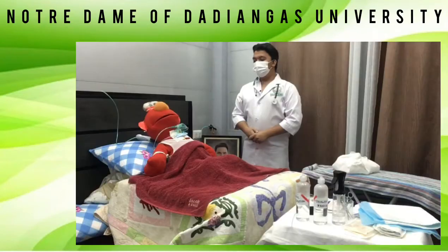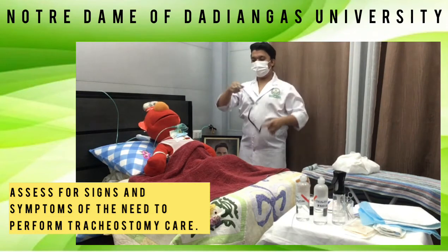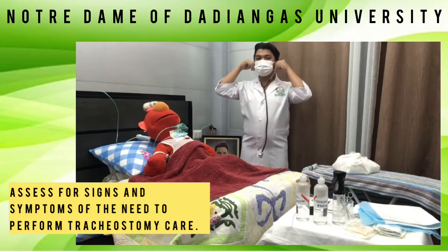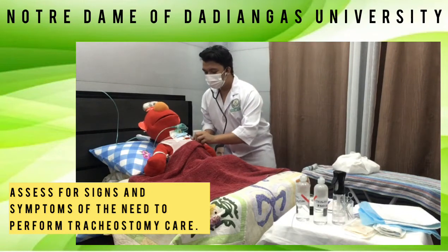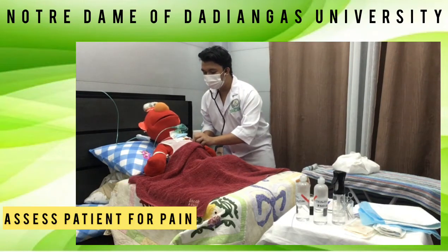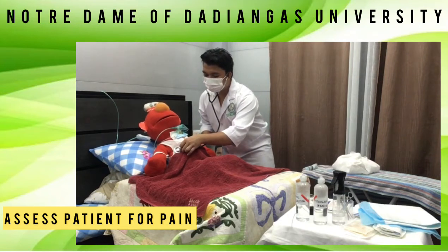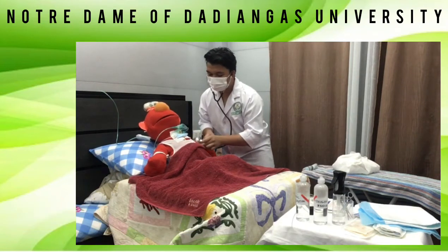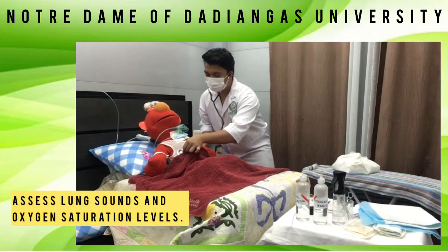Assessment. Assess for signs and symptoms of the need to perform tracheostomy care. Assess the patient for pain. Assess lung sounds and oxygen saturation levels.